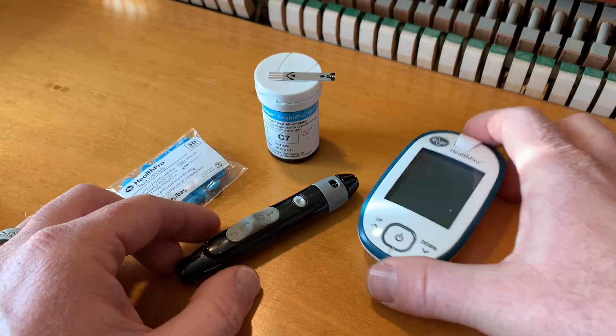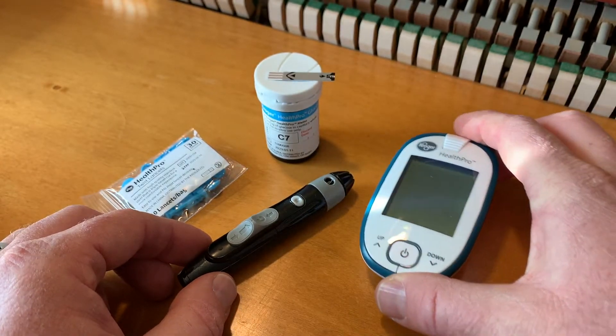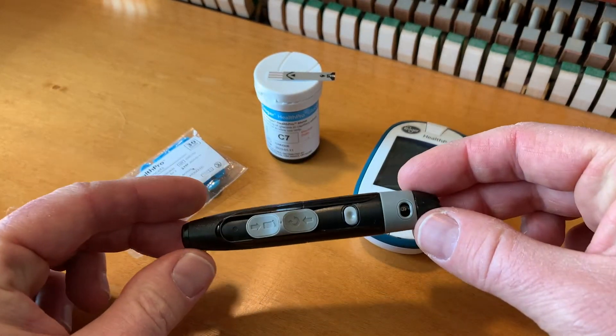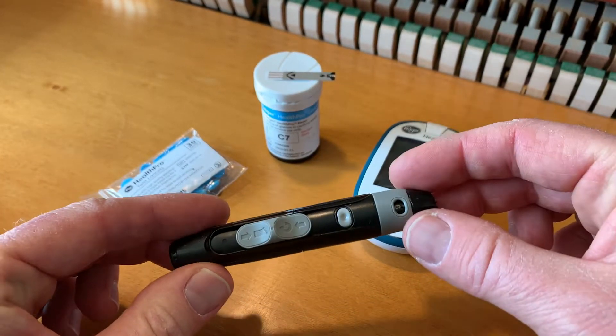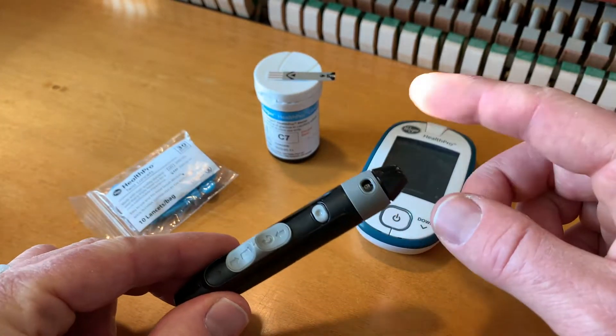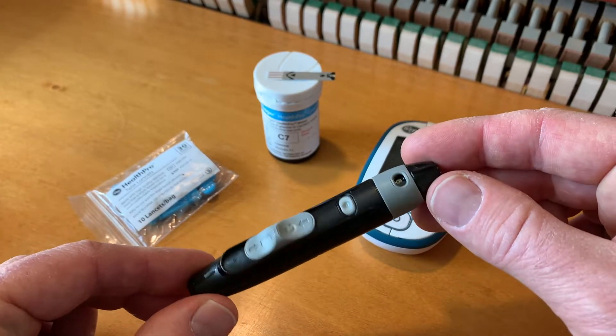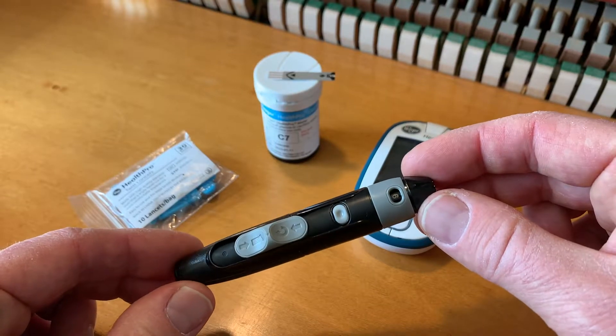Hey friends, on today's video we are looking at the Kroger Health Pro blood glucose monitoring system, and specifically we're looking at how to load this little lancer. This is the lancet that you need to put inside this. It's going to prick your finger and allow for a blood sample. We're going to show you how to load this thing and how to prep it for that sample.